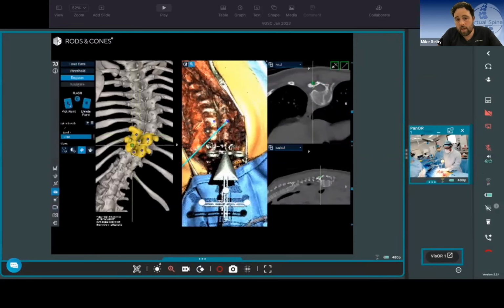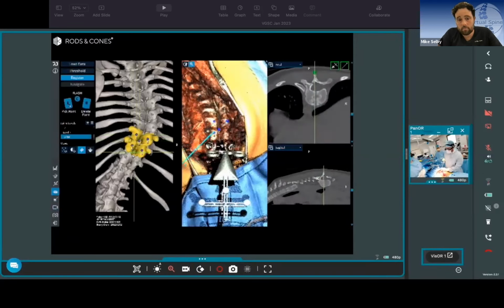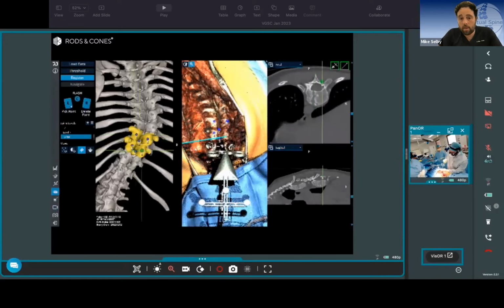So this is just a very standard registration. Now 10 may have to just move down a bit here, up towards the head, cranial, sorry. And what we're looking at in that middle is the picture of the spine open. It's got to get around the clamp.